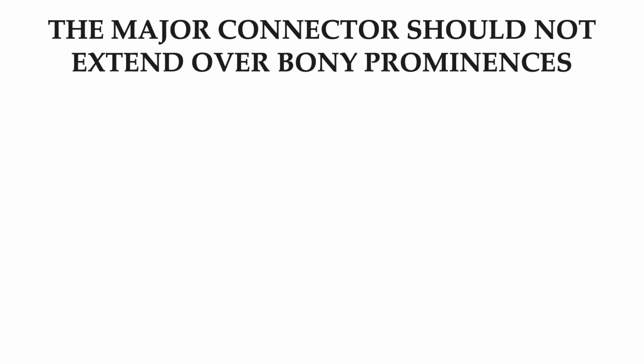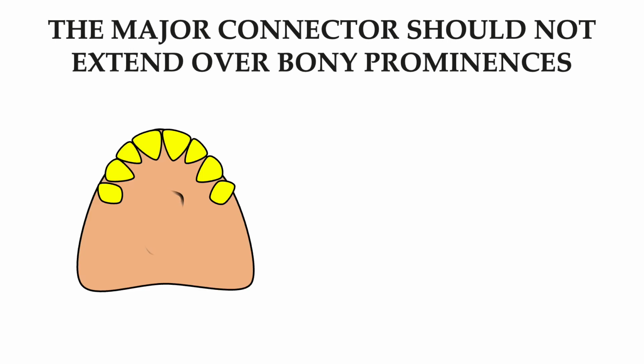The major connector should not extend over any bony prominences such as tori. Look at the figure. We have a small torus in the center of the maxilla. What is the design in such cases? So for the design of the major connector in such cases, we have two options: either we cover the palate or we give a relief over the tori area. So look at the figure.